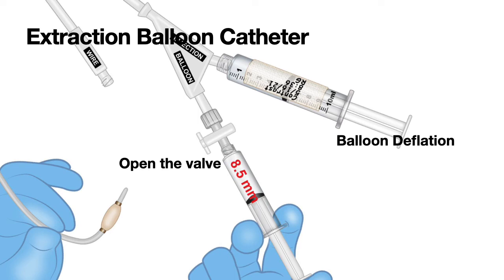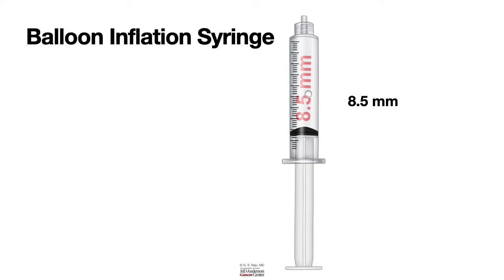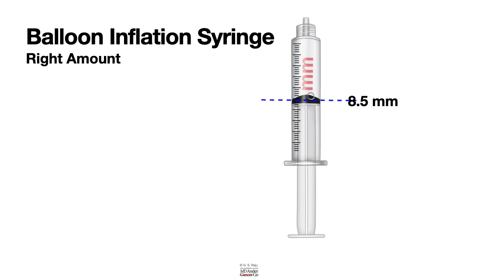Now let us look at the balloon inflation syringes. There are three different sizes of syringes; here we have the 8.5 millimeter syringe. To know whether your balloon is inflating the right amount, you can see a small side hole that allows you to size the balloon to the appropriate size. When you inject, most of the air escapes, and once it goes past that 8.5 millimeter hole, you inflate the balloon to 8.5 millimeters.